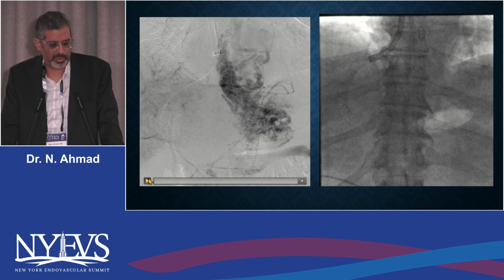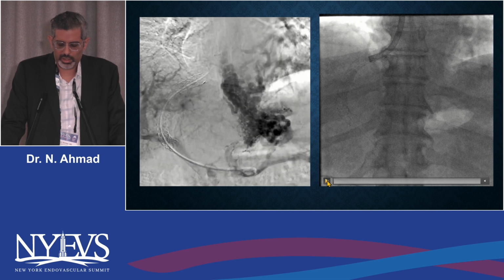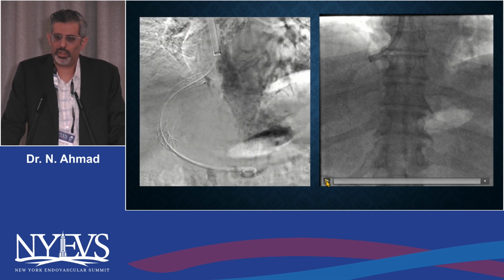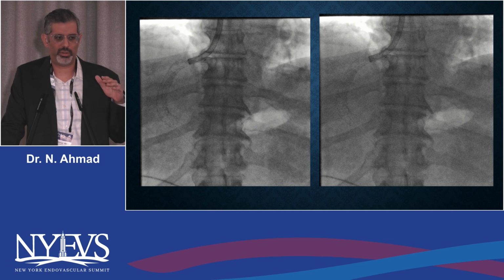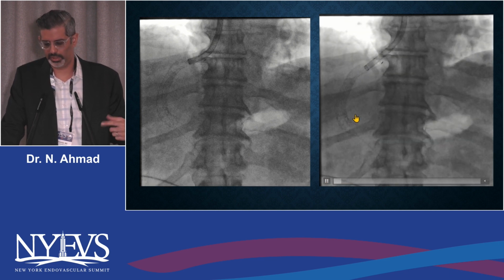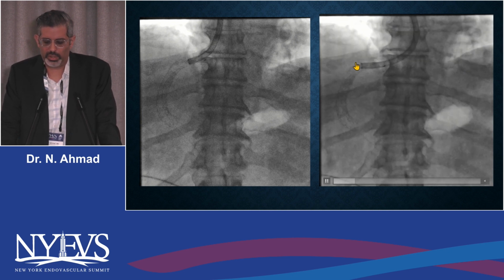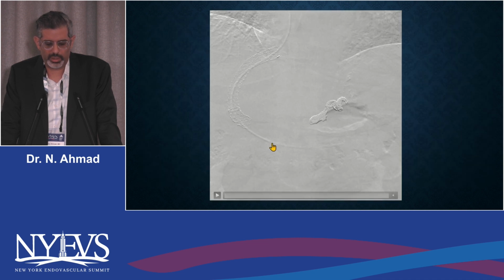This was a patient with a thrombosed TIPS. This is just to highlight the torqueability of this catheter. This is the only situation, I think Dr. Harnain alluded to this, that with a lot of these catheters, I didn't mention this earlier, you don't use it over a wire. When you're in the iliac system, you're aspirating without a wire, just pushing a catheter forward, which is not really intuitive, right? We don't usually do anything without being over a wire. But this is one situation where I use Flash over a wire, within a TIPS stent, essentially. So you see that there's nice torqueability within the stent. Again, just 1 pass was able to clear out all this clot, and it was nice. This is actually relatively older clot.